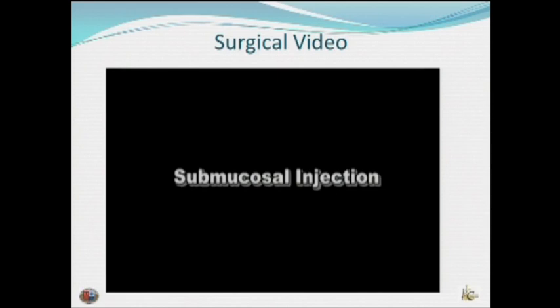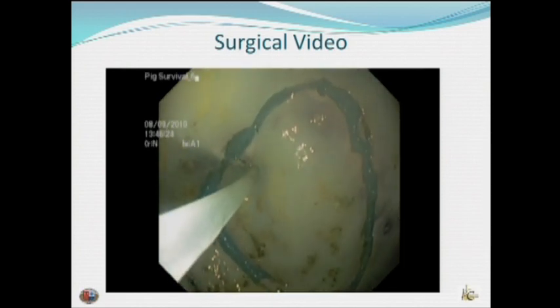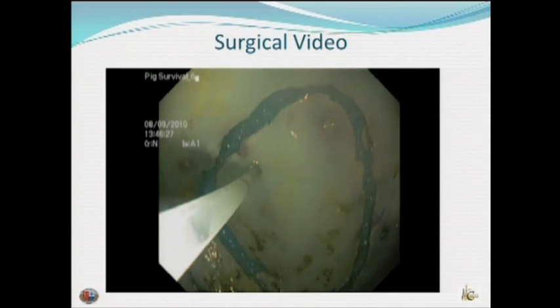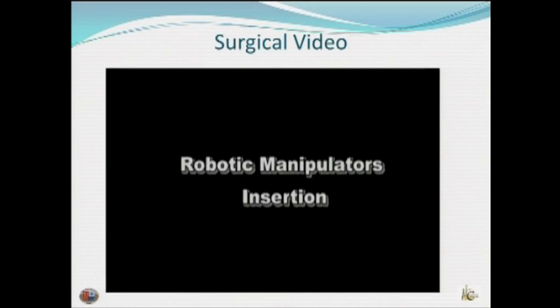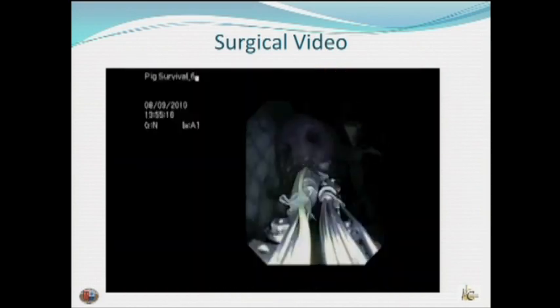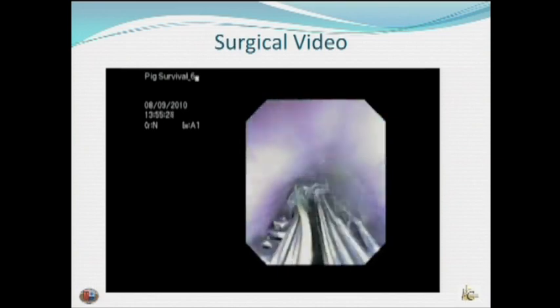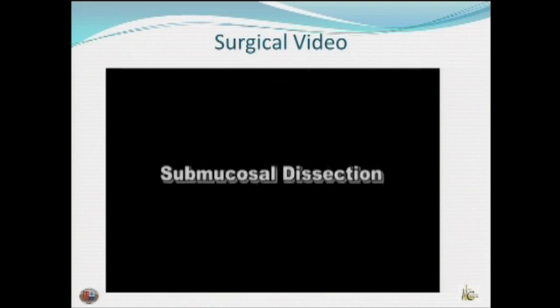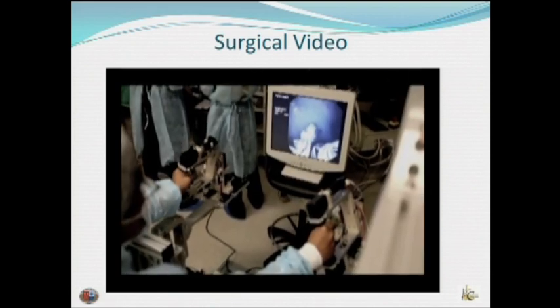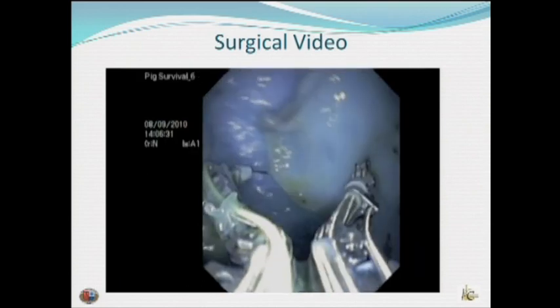Again, the lesion is elevated with the submucosal injection of the methylene blue dye. After this, the robotic manipulators are inserted, which are mounted on the forward-viewing endoscope over the overtube. The advantage of this master robot is the triangulation. As we can see, the surgeon controls the two arms, and the endoscopist controls the slave manipulator.